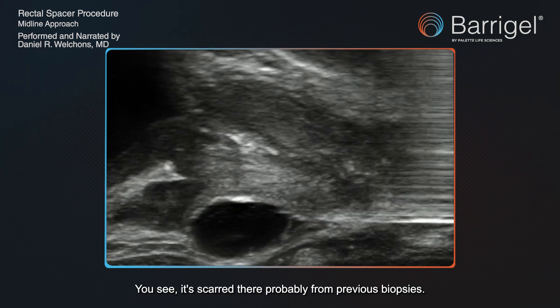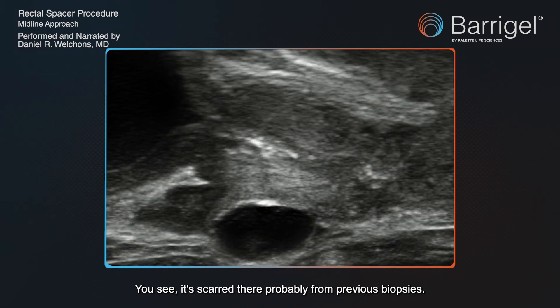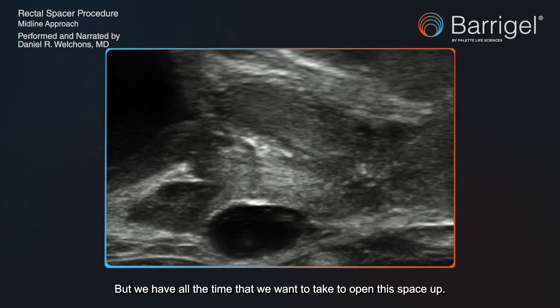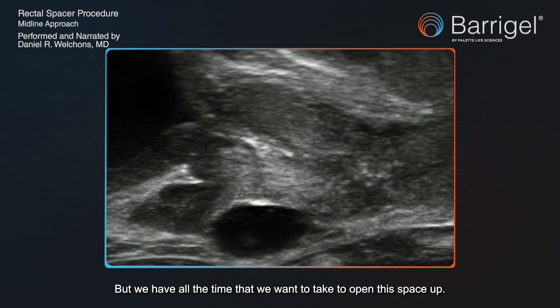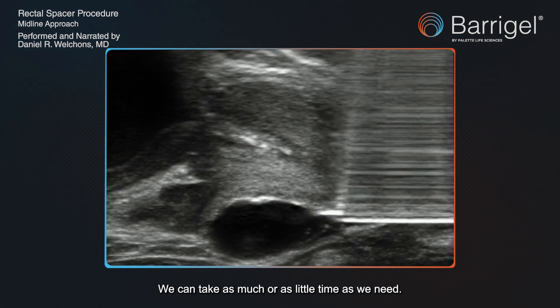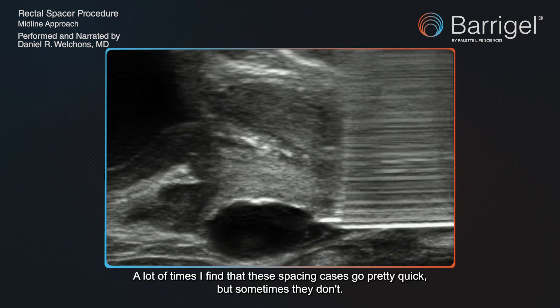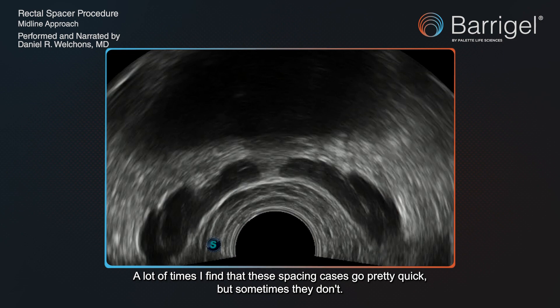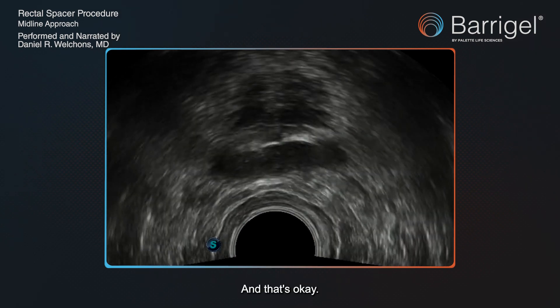You can see it's scarred there, probably from previous biopsies. It's not too uncommon to see that, but we have all the time we need to open this space up — we can take as much or as little time as necessary. A lot of times these spacing cases go pretty quick, but sometimes they don't, and that's okay.